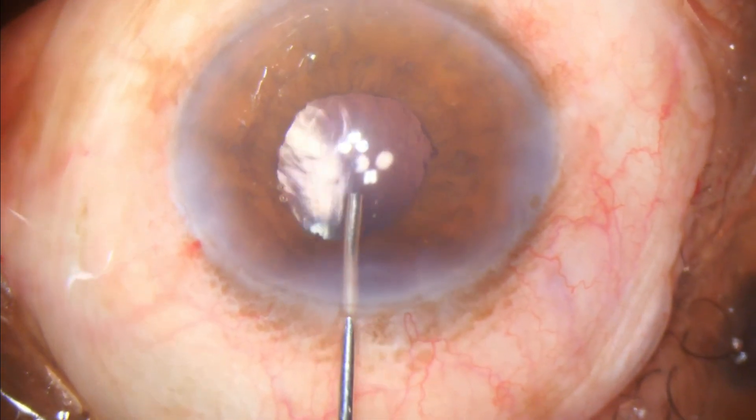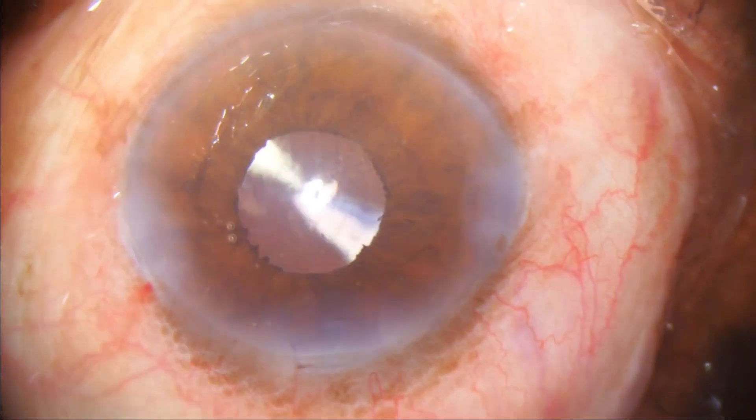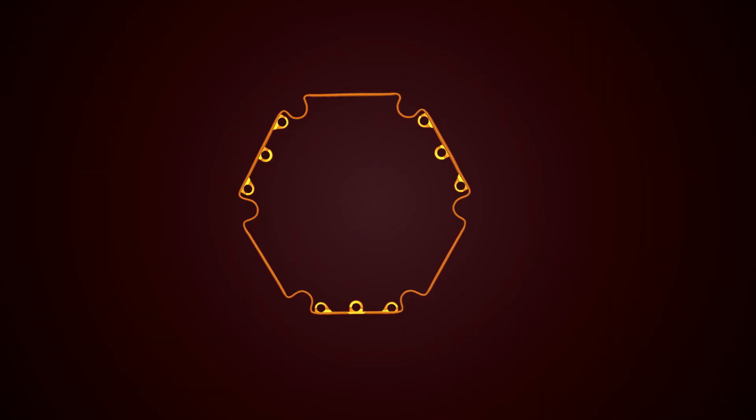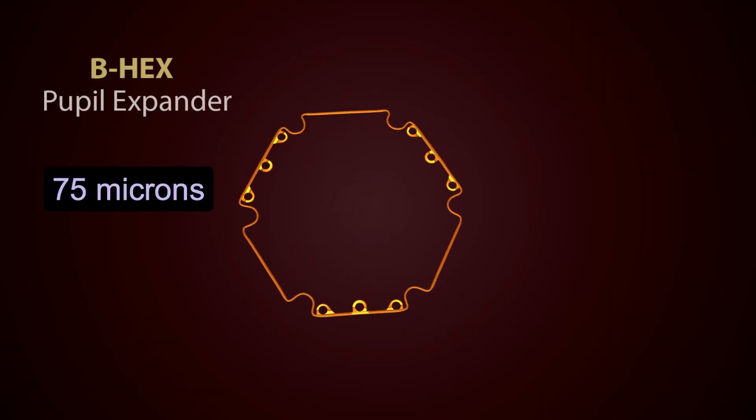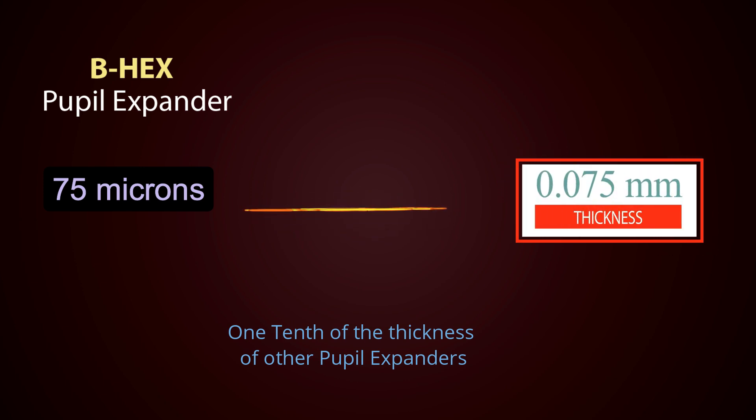It is so gratifying to see a nice round pupil at the end of surgery. At only 75 microns, the B-hex is one-tenth the thickness of other devices.